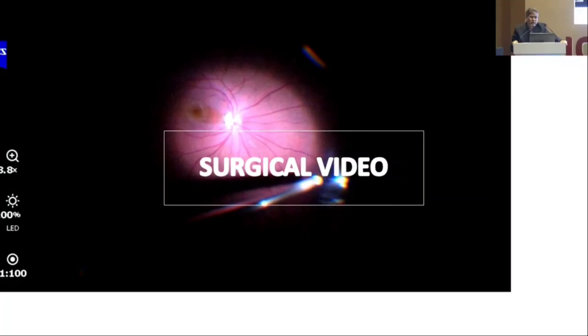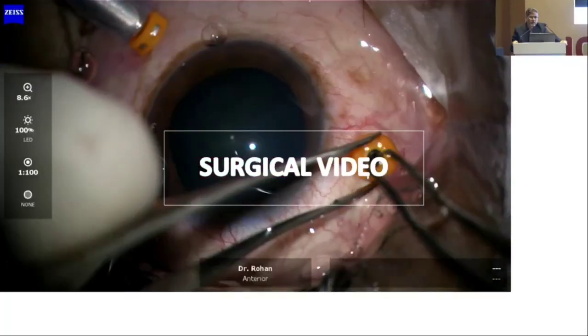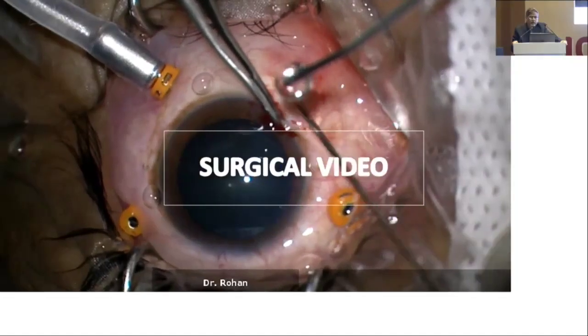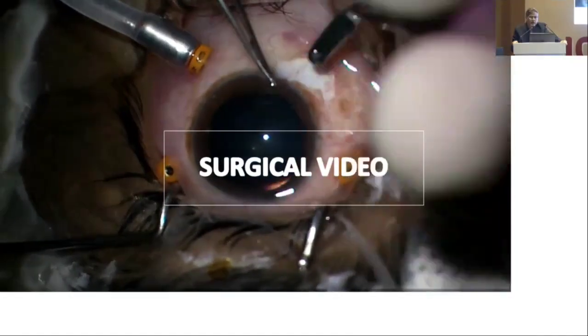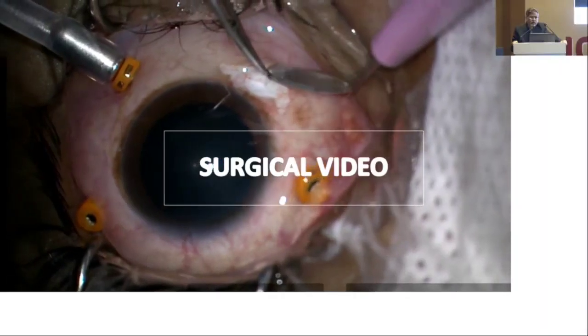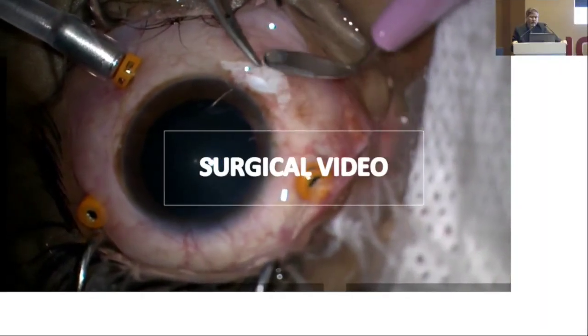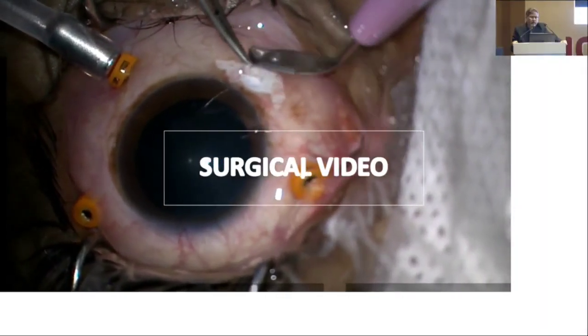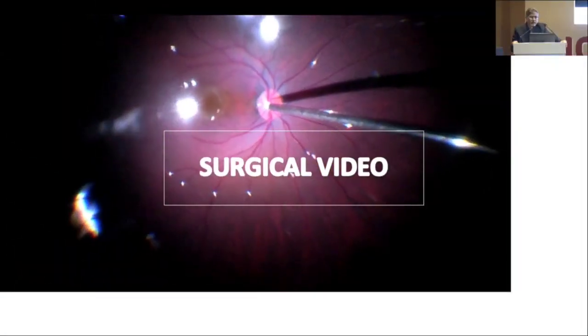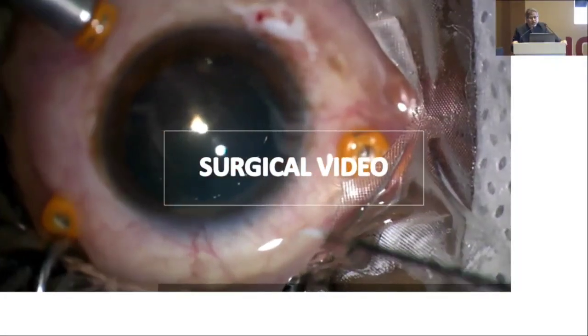As you see, complete vitrectomy is very important to remove the vitreous traction. And here we are using a scleral plug. From the sclera we are taking part of scleral tissue. The important thing is we have to have a watertight closure of that pit. The pit communication is deeper, not at the top, so that can be assessed with OCT, swept source OCT.